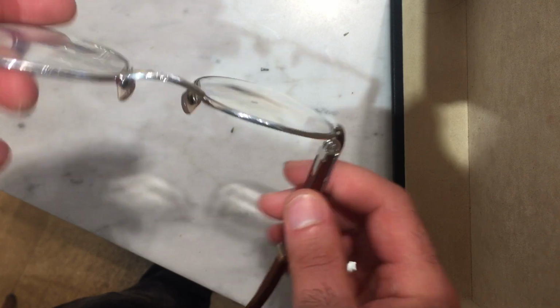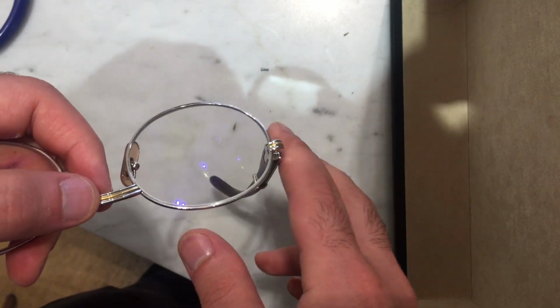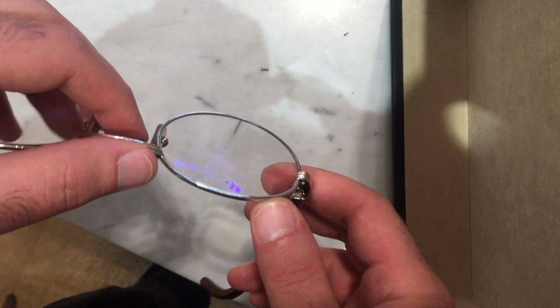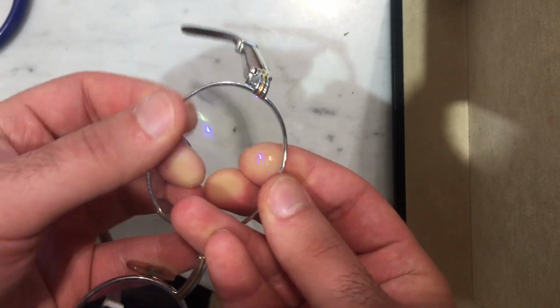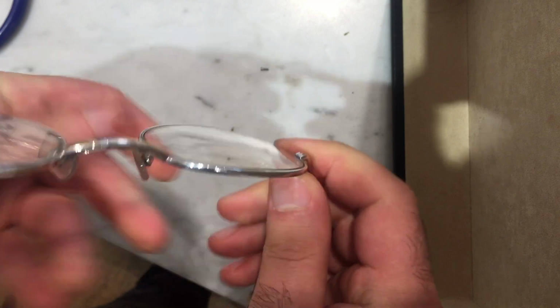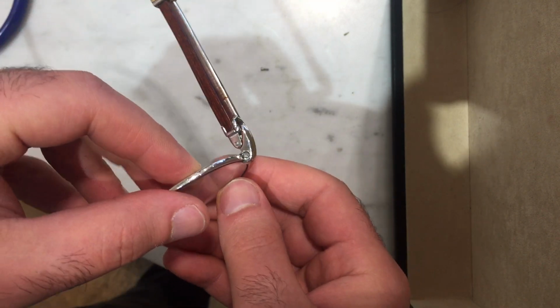Let me tell you about this. This isn't something I recommend doing, what I'm about to show you, but it's a trick of the trade that you can do when you don't have the right things around. So the situation here is that our lens is too loose, so it's very easy to, look at that, pop out. And we don't want that, and the screw is super tight already.